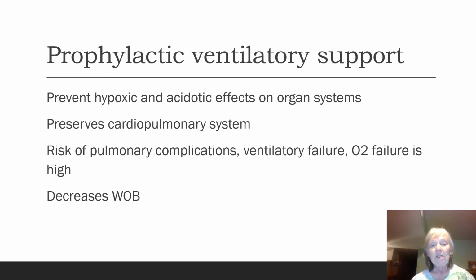So the things we need to watch for: we want to preserve that cardiopulmonary system as best we can. We don't want to cause more of a shunt or anything else going on there. We want to decrease the risk of pulmonary complications, ventilatory failure and O2 failure.